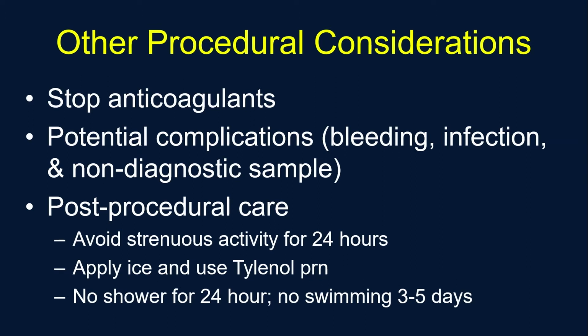The potential complications that you'll talk to patients about are bleeding, infection, and even potentially that you may have a non-diagnostic sample. The other thing that I tend to tell patients a lot is that sometimes there are a few benign diagnoses we get that do require surgery, and we'll go through that list in just a minute. Because patients sometimes are told it's benign, but then they're told they have to have surgery, and they're like, why would I have surgery? It's benign, it's not cancer. So I do think sometimes preparing the patient up front actually helps them to have a slightly better experience if that does happen to them.